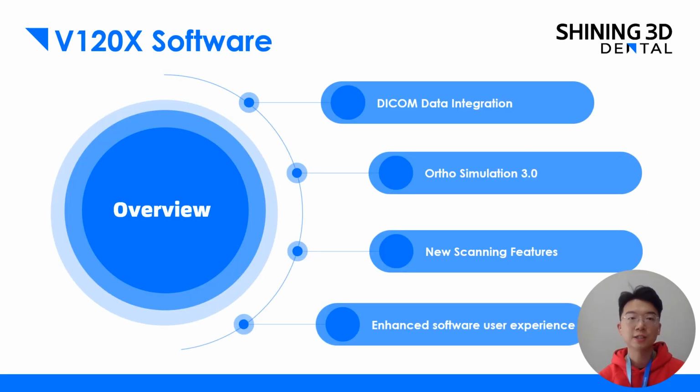And now we enter the final part of today's update features in our V120X software, which is enhanced software user experience.